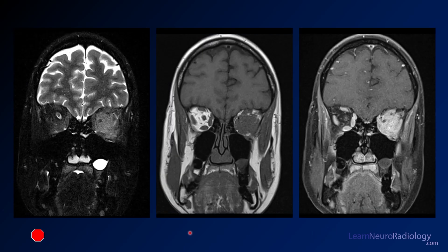On coronal images, the T2 with fat saturation shows an inflammatory blob in the orbital apex, and the orbital fat is not suppressing. On T1, the orbital fat is displaced to the side with a mass in the orbital apex. On post-contrast imaging, the entire area enhances avidly. The small central dot is the optic nerve, which is actually spared but encased by the avid enhancement.